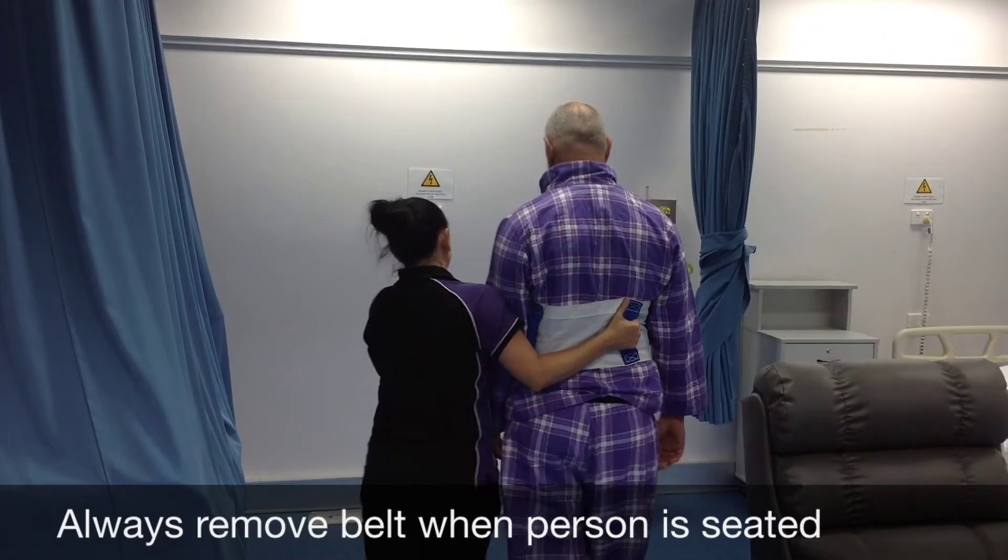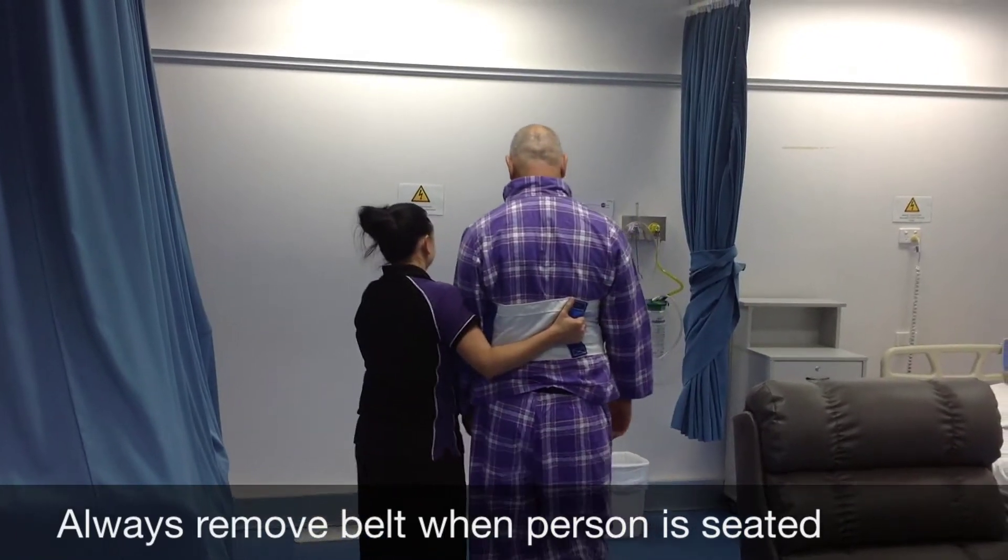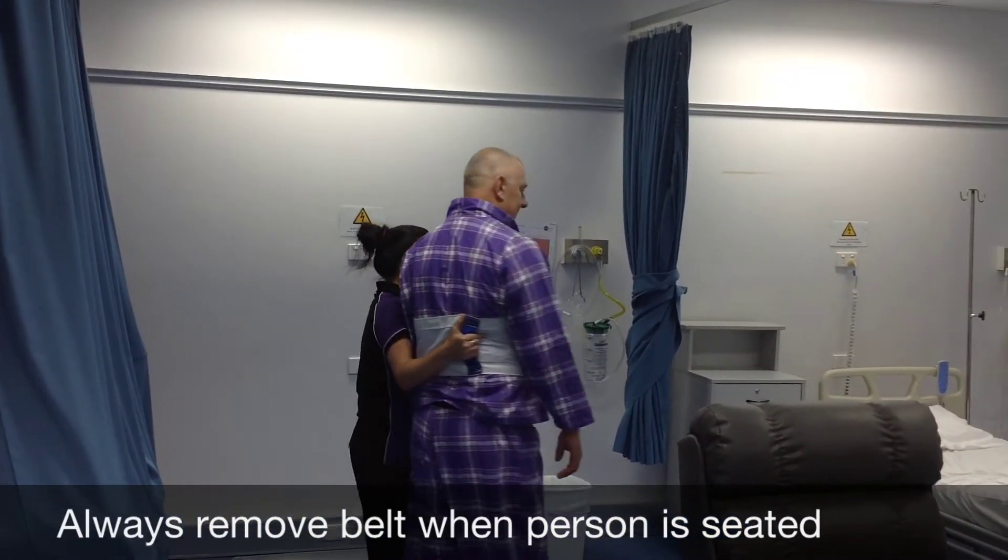Notice where Chantel is hanging on — she's got a really good grip on this client because he's much taller than her.